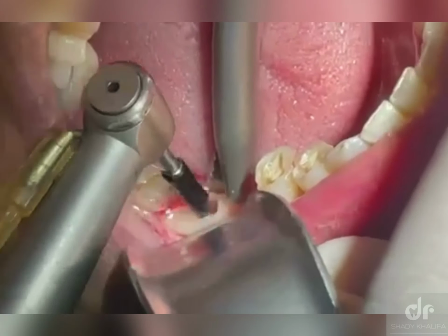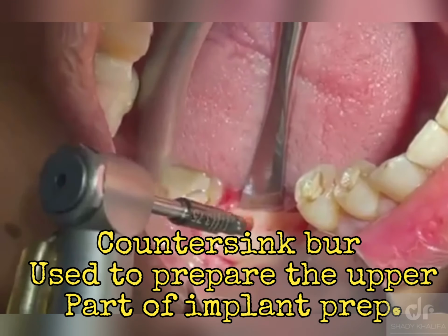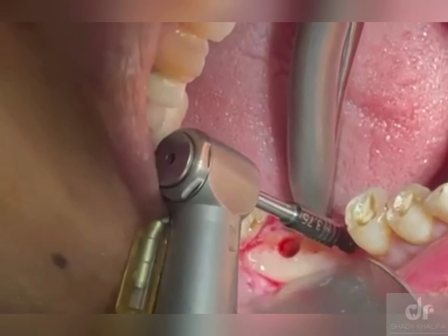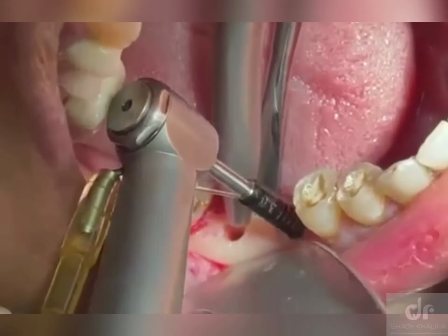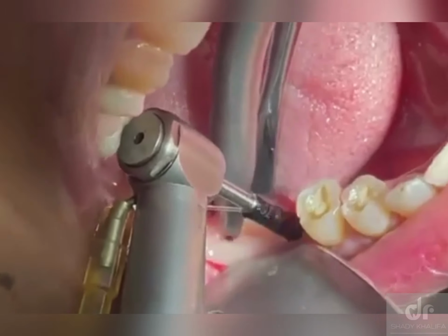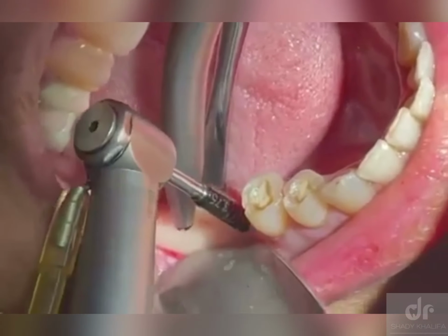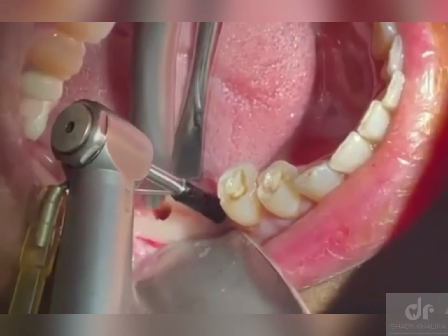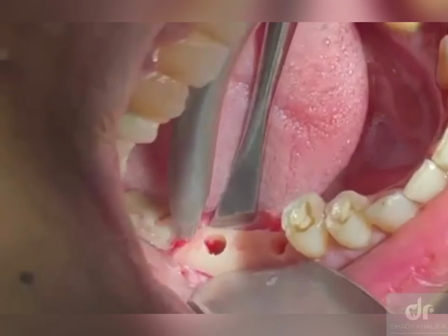The countersink drill burr, we use it mainly in the lower jaw. So we widen the upper part only. Maybe we pass 3-4 millimeters approximately to widen only the upper part, so the implant body can go in easily. It will be very difficult to go without the countersink burr.